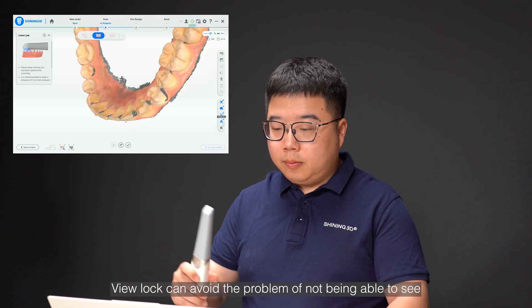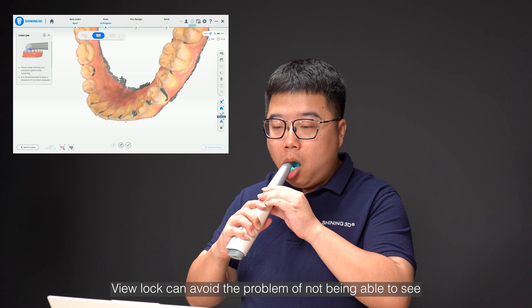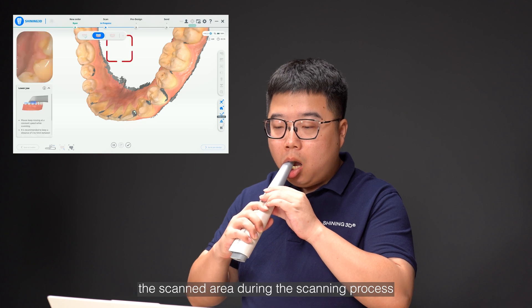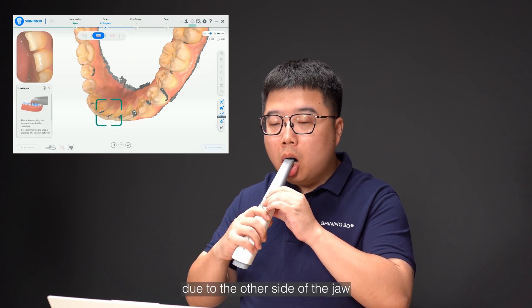ViewLock can avoid the problem of not being able to see the scanned area during the scanning process due to the other side of the jaw.